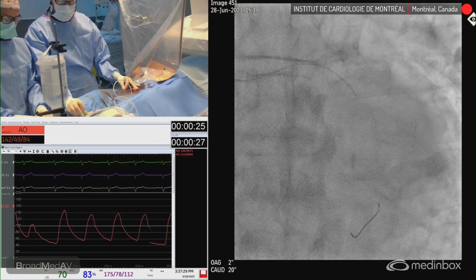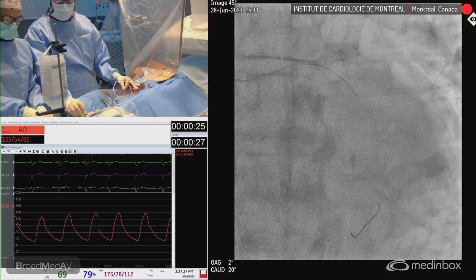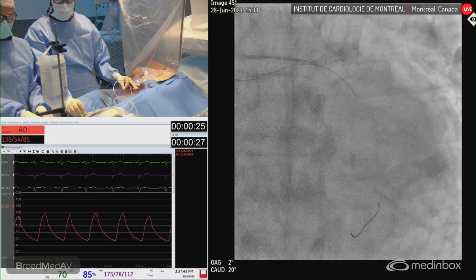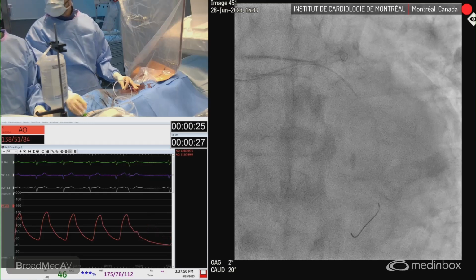Glide assist. So we hold 3 seconds. There we start. Glide assist. Glide assist. Now it's not working. Is it glide assist?